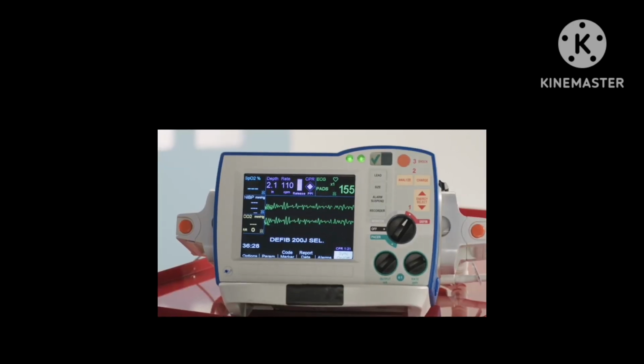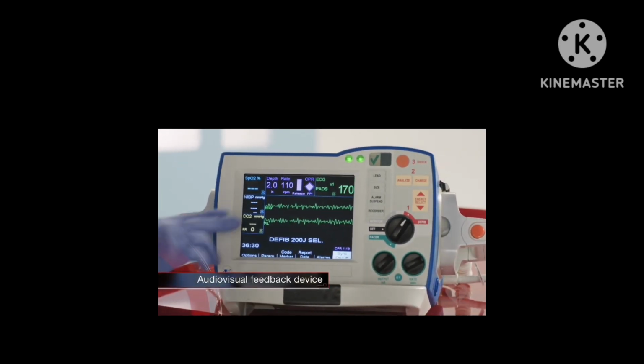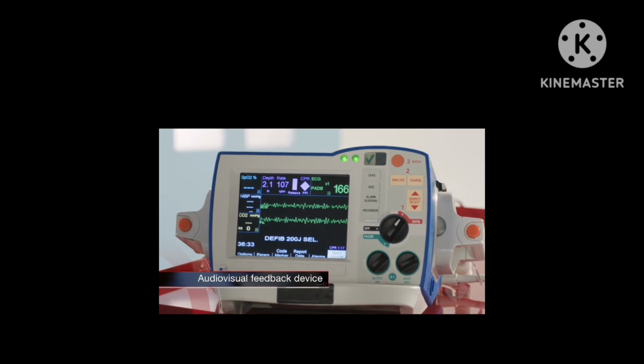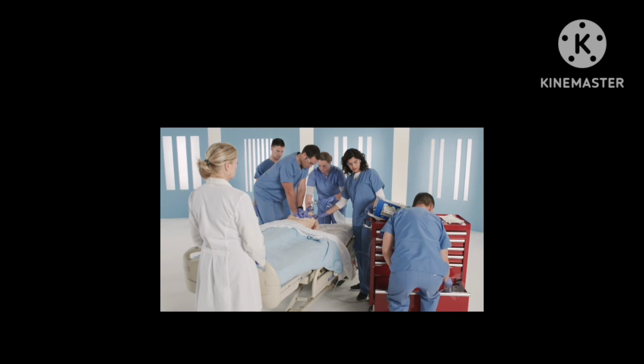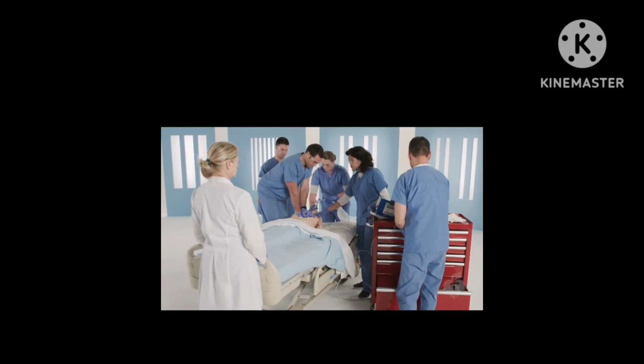The most effective way to implement the role of a CPR coach is with a real-time audio-visual feedback device. We'll discuss some of the functions of the CPR coach and how they use feedback devices. First, let's talk about the team layout when using a CPR coach.